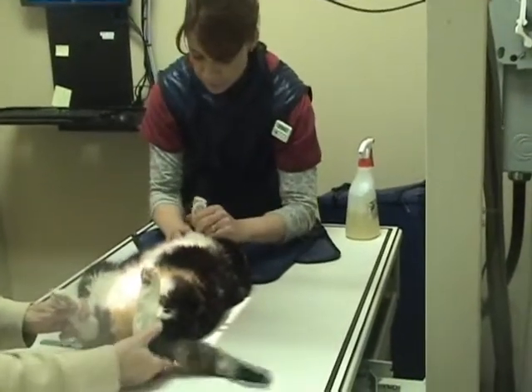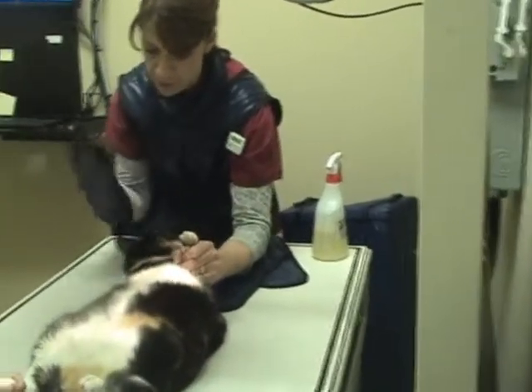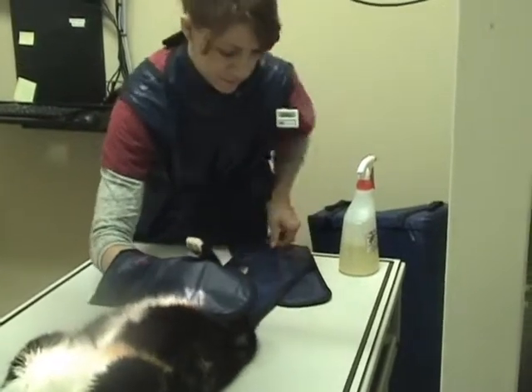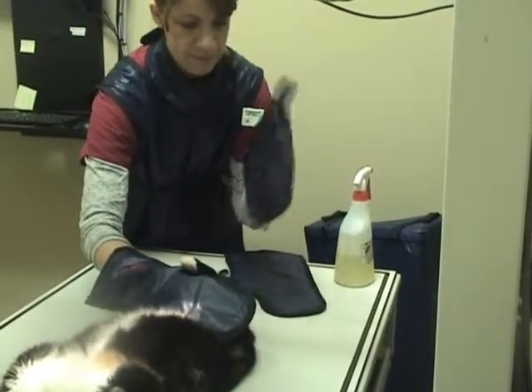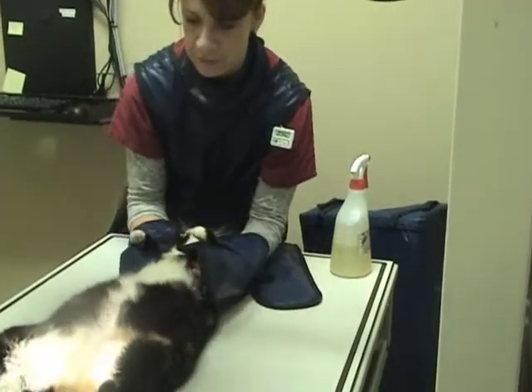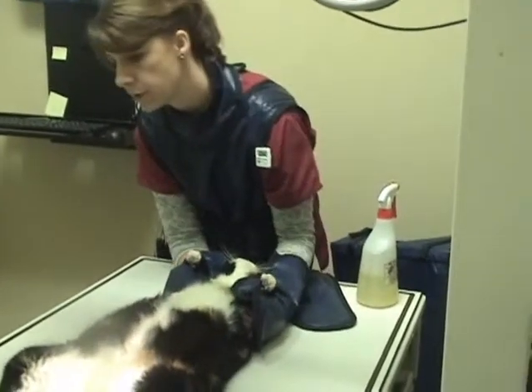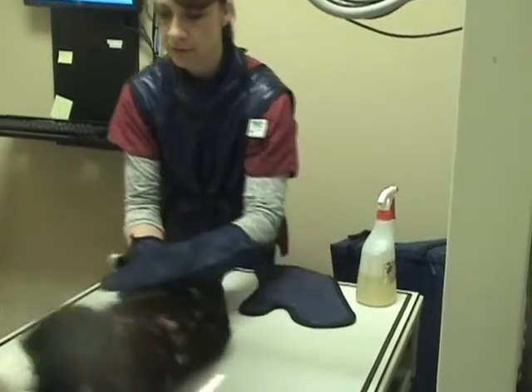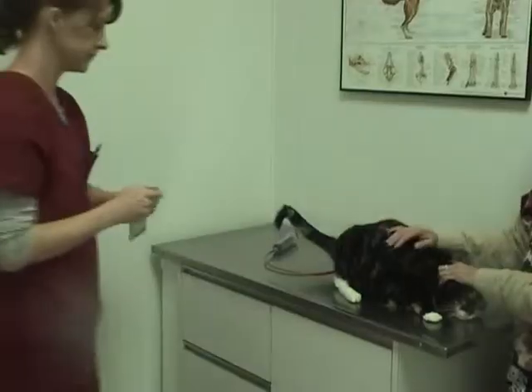When taking the X-ray for the VD, you want to place the cat on their back and extend their front legs cranially and pull their back legs caudally. Again, you want to have the center of the X-ray beam at approximately the 13th rib to get a good diagnostic view of the abdomen.